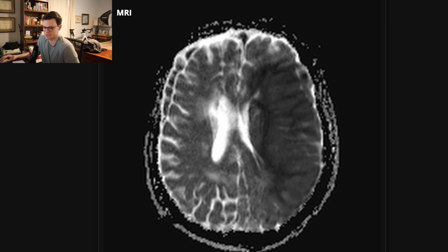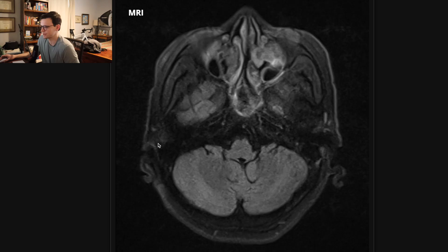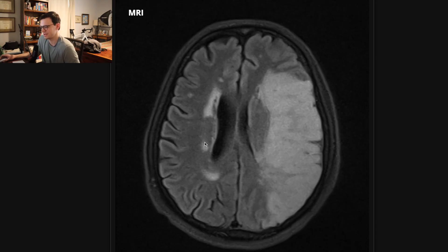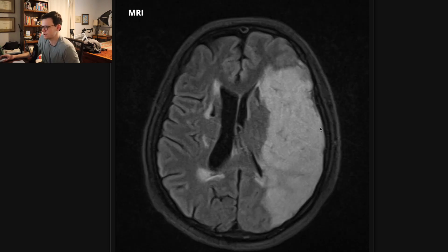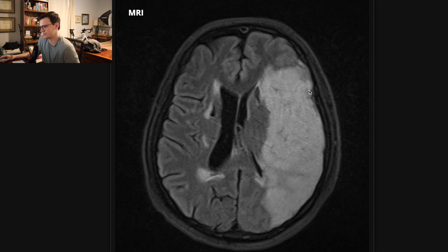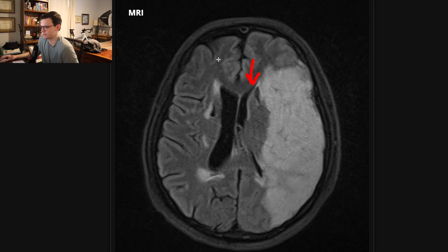You can also see strokes on other sequences. FLAIR is also a good sequence to look at — it's a T2-weighted sequence where you suppress the CSF. Notice there is gyral swelling, meaning the brain is swollen; you can't really see the sulci like you can on the other side. You can also tell the brain is swollen because the left lateral ventricle is compressed compared to the right lateral ventricle, which is much more normal in caliber. All that swelling is causing mass effect on the ventricle, compressing it.